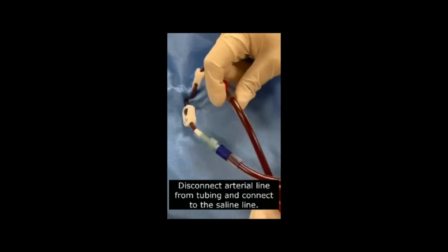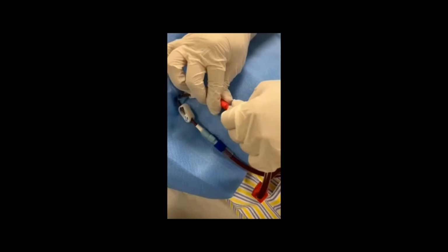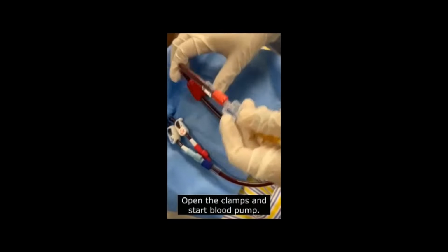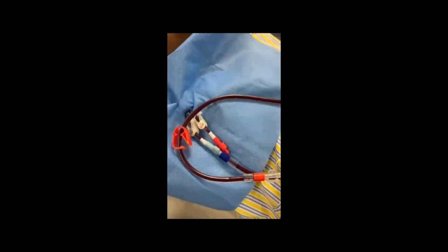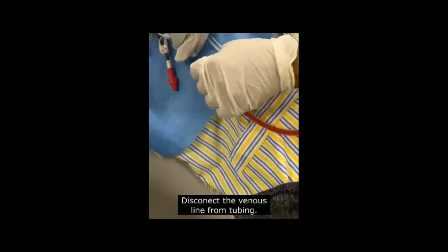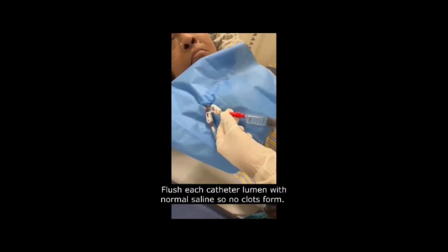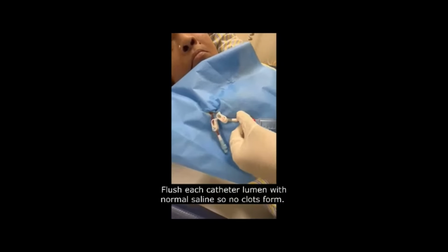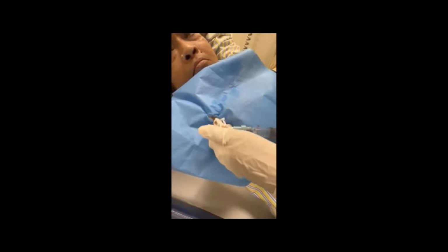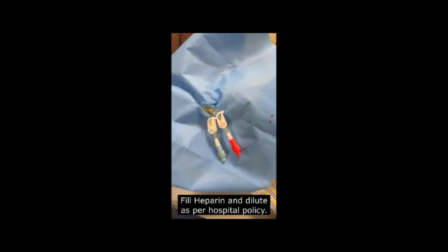While disconnecting the patient, first disconnect the arterial line from the tubing and connect it to the saline line. Open the clamps and start the blood pump. Disconnect the venous line from the tubing after the blood has been returned. Flush the catheter lumen with normal saline so that no clots form. And close the catheter line with a heparin lock or a citrate lock.